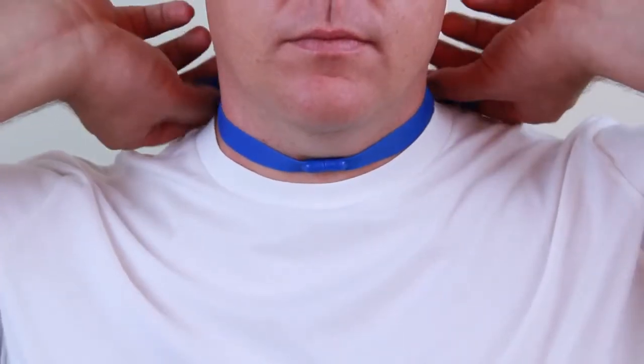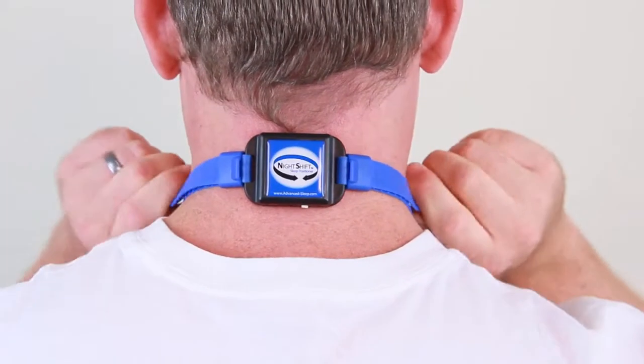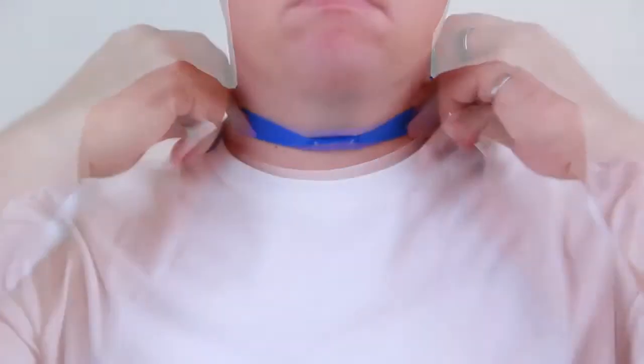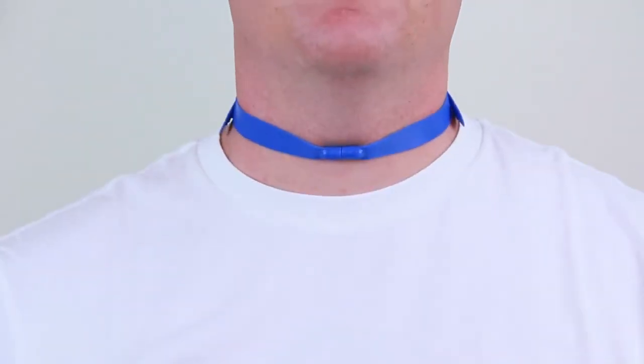Now fasten the magnetic clasp. Grasp the strap ends on both sides and pull evenly until the Night Shift is secure, while keeping the device centered on the back of your neck and the magnetic clasp centered on the front. If adjusted properly, two fingers should fit between the strap and the neck on each side without causing the magnetic clasp to release.